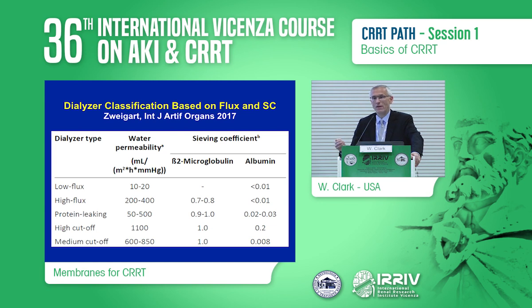So these newer classification methods combine water permeability, that is KUF, along with solute permeability or sieving properties. This is just an example of a proposal for combining water permeability with, for instance, the sieving coefficient for two important molecules, beta-2 microglobulin and albumin.